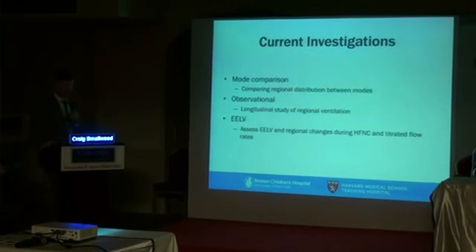So last couple slides, I just wanted to make you aware that EIT is definitely an investigational technology in the United States right now. In places in Europe, especially Germany, people are using it clinically. But I will tell you that my personal bias or opinion about EIT is that right now, I think we would have enough data to start using it in our ICU, albeit we can't do that without FDA's approval. But there is much work to be done for specific applications. And so we have a number of investigations to answer some open questions that we see in our ICU and in the literature in general.